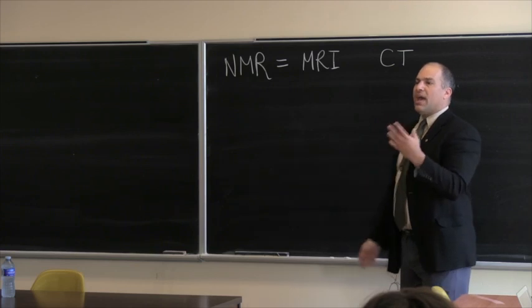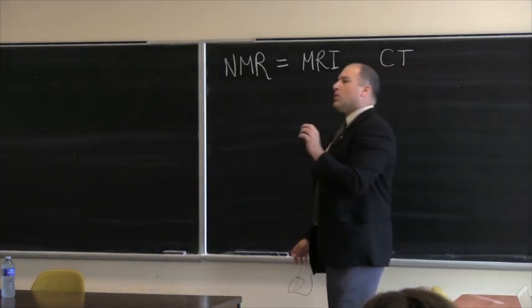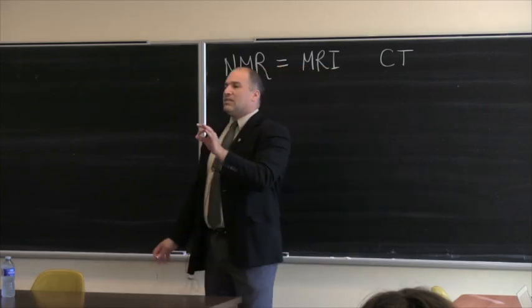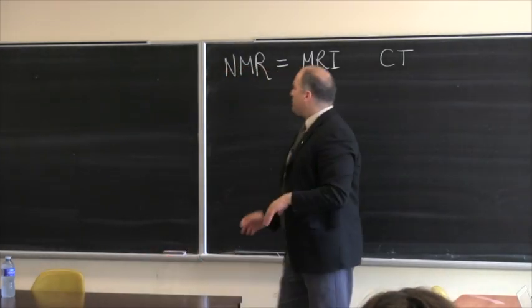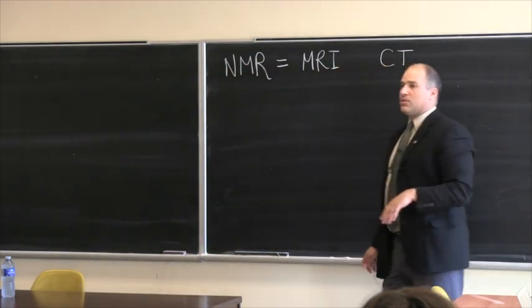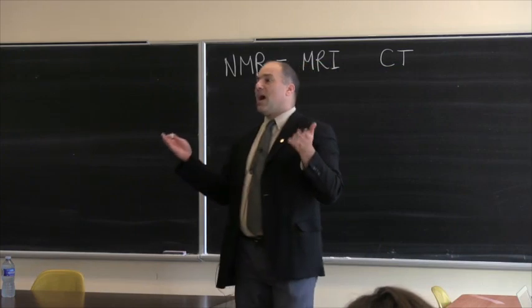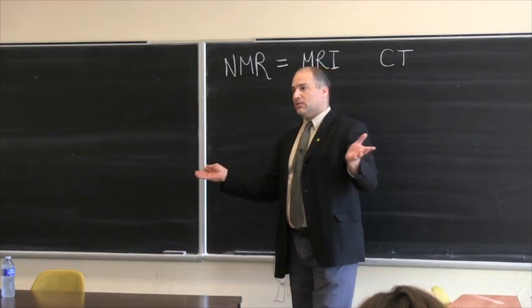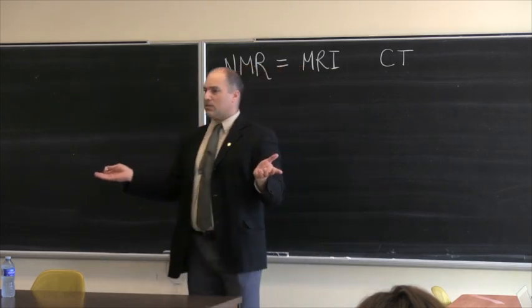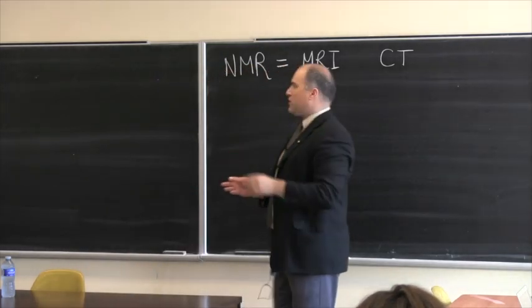So we've had good experience with MRI, good in the sense that we know that it's very unlikely that it's detrimental to your health, at least in the fields that we're using. When MRIs were introduced, they were introduced at a very low grade. We were not able to generate very high magnetic fields. They were fairly small. Now, the Earth has a magnetic field. This magnetic field is very important for certain animals, like birds that migrate and other animals that do all kinds of interesting things, especially fish.